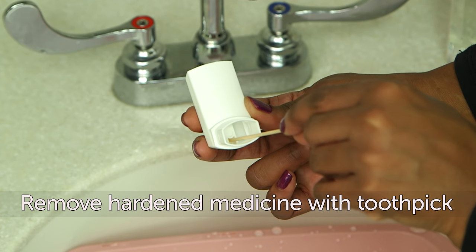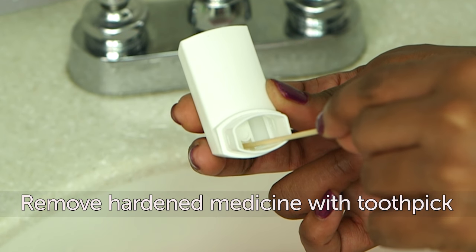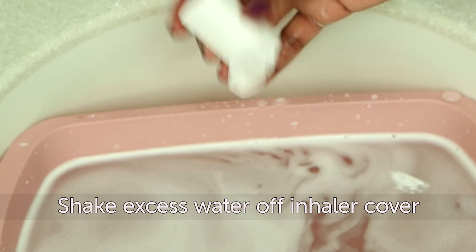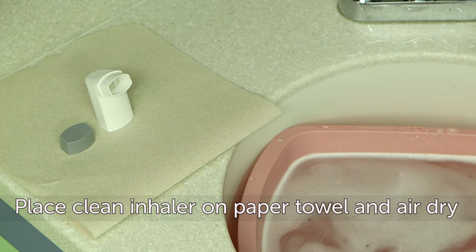If any hardened medicine is stuck on the inside of the plastic inhaler cover, use a toothpick to remove it. Shake any excess water off of the inhaler cover, then place the inhaler container and cap on a clean, dry paper towel to air dry.